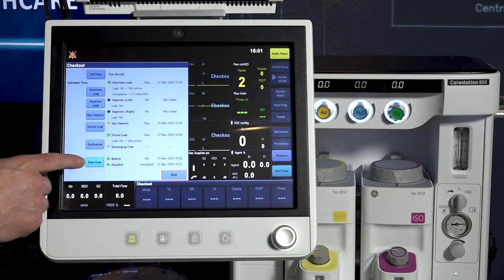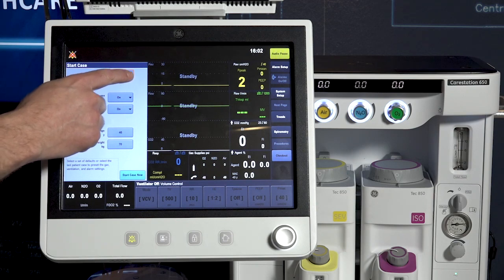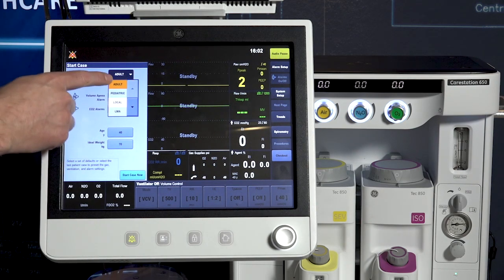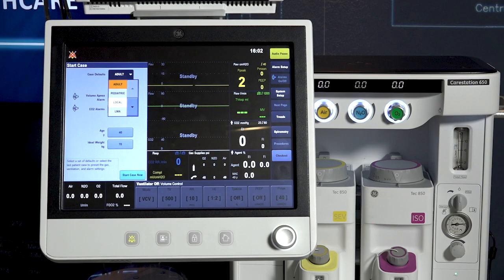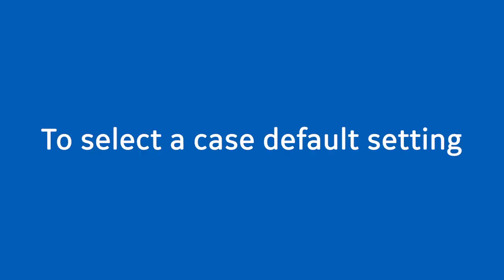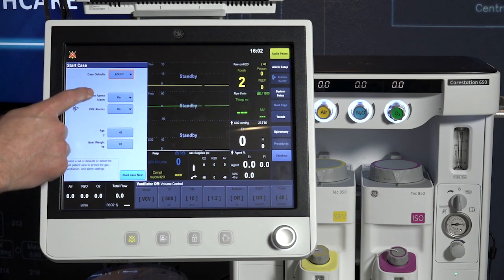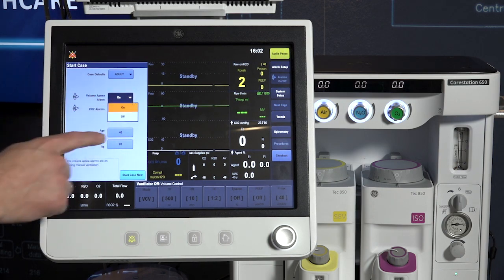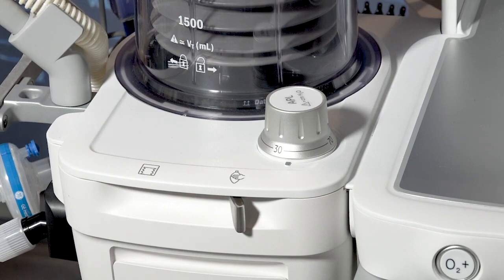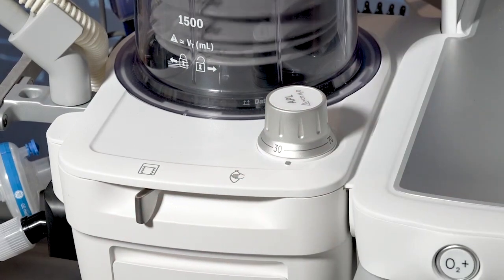Use the start case menu to set the case data and start the case. A case can be started using default or custom settings. The case default selection shows the four default case types and the ability to use your last case setting. Each case type has preset values for ideal weight, age, and volume apnea alarm. To select a case default, select a case type from the menu. The volume apnea and CO2 alarms can be left on or turned off. If turned off, they will turn back on once the bag to vent switch is moved to vent.